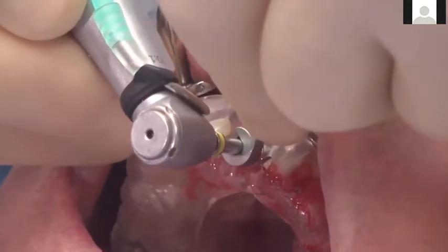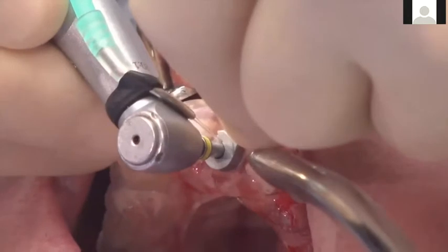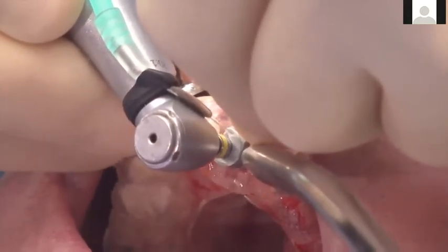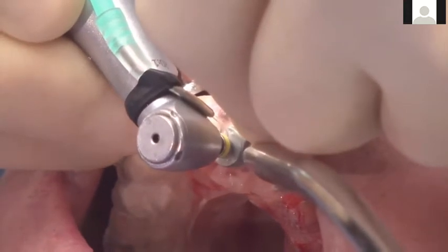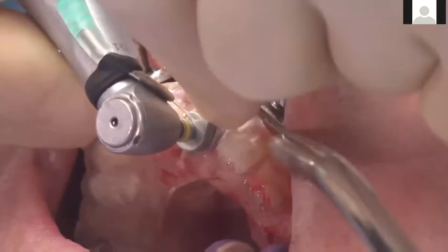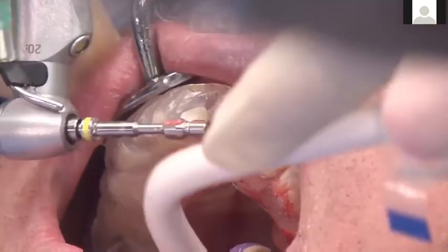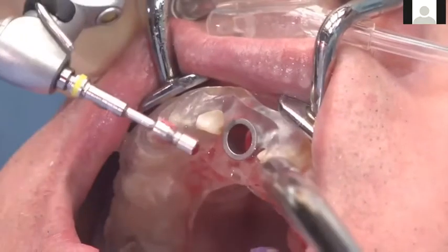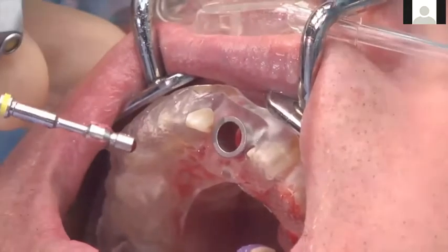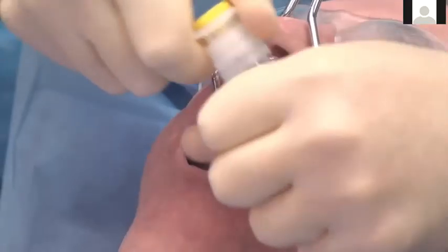So I like to profile the bone before placing the implant. I always use this. Now in softer bone, I may not go all the way to the hub. I may stay about 1 millimeter or 1.5 millimeters short, but most of the time, if it's a little denser bone or medium dense bone, then I go all the way to depth, as you can see here. And you can see the bone that's been basically harvested with this profiling. Now, if you don't do this, then you may put too much pressure on that thinner cortical bone, and then that cortical bone can then resorb.